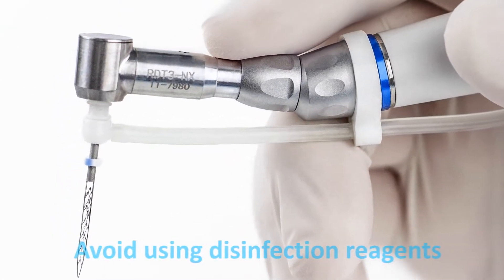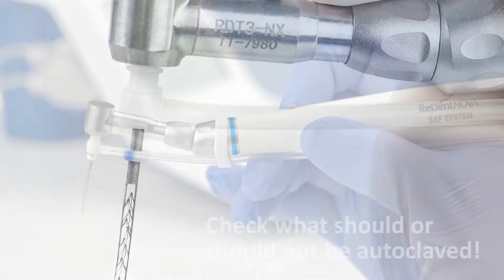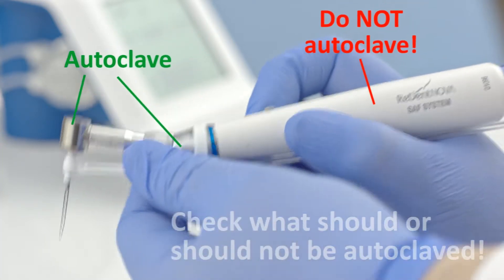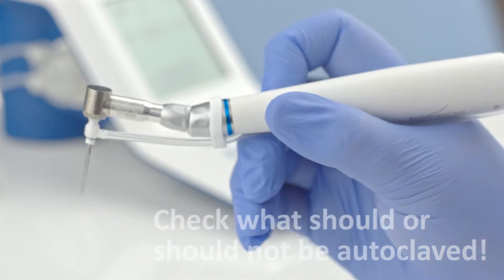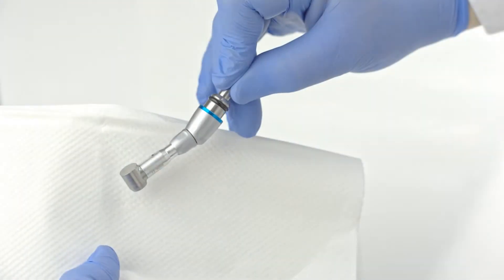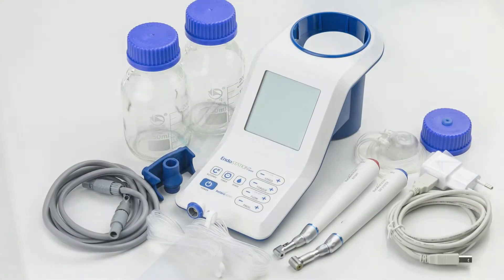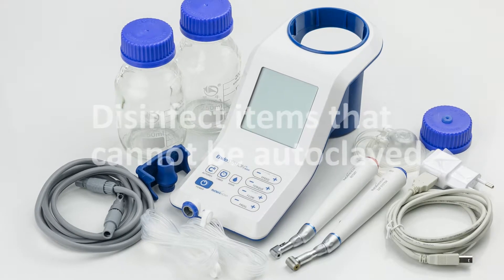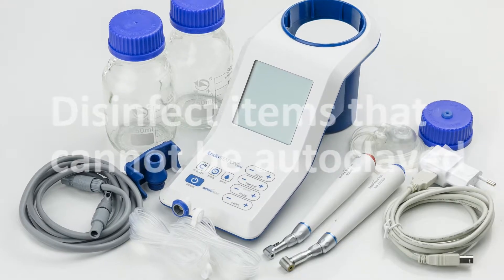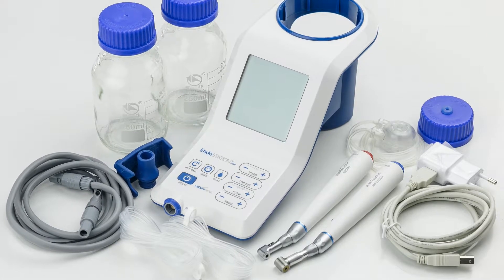Avoid using disinfection reagents, as some may cause deformation of the SAF's plastic parts. Make sure to autoclave only parts of the endodontic motor that are explicitly intended for sterilization, as defined in the instructions for use, such as the handpiece head and adapter. Refrain from autoclaving parts that should only be disinfected, such as the micromotor or the cable. Disinfection by a mild detergent or alcohol wipes is recommended for all parts that are not autoclavable or disposable and are not inserted into the patient's mouth. Do so carefully to avoid unnecessary scratches or damage to the plastic surfaces.